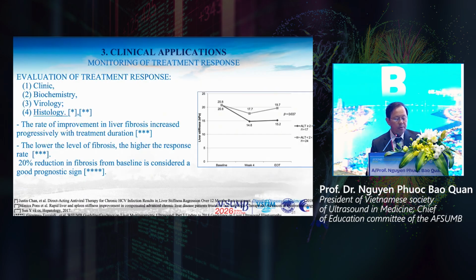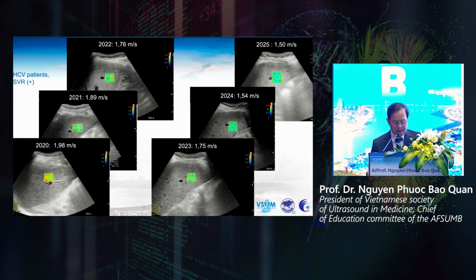And we can use multi-parametric ultrasound to follow up the response of the patient when we treat the patient. In this case, I followed up this patient from 2020.